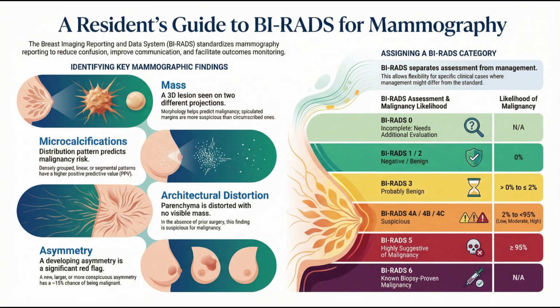Okay, moving on from masses. Let's talk about the thing that I think causes the most patient anxiety. Calcifications. Yes, and these tiny calcium deposits are incredibly common. But the devil is in the details. Their specific shape and distribution are everything. So many are completely harmless. So give us a few examples of the safe types of calcium.